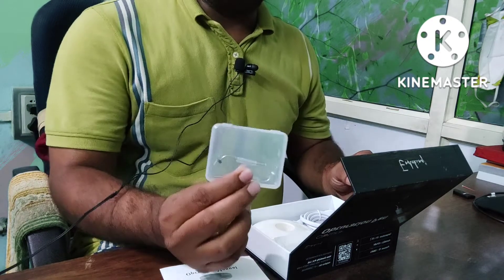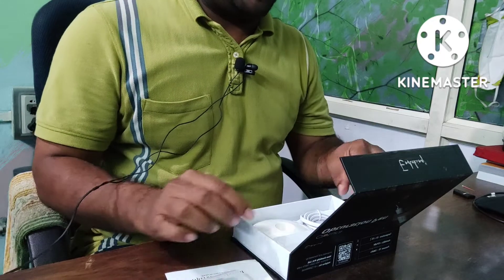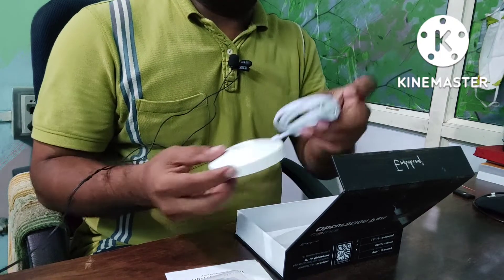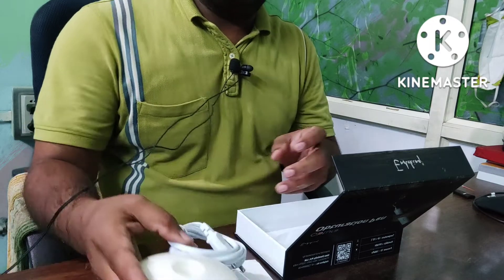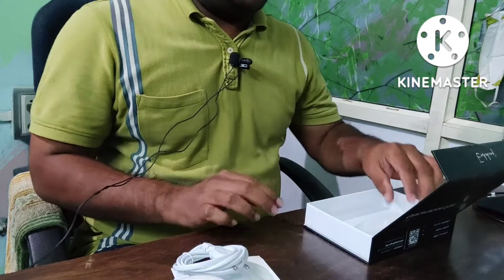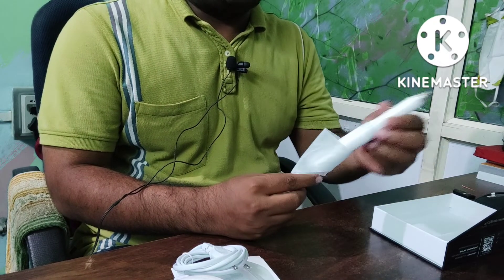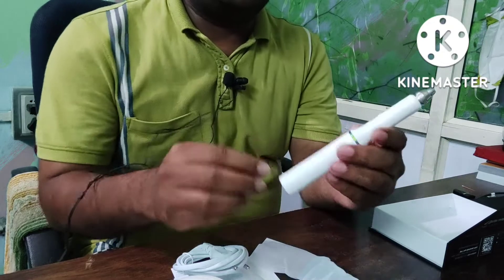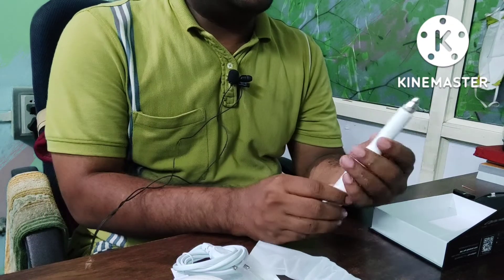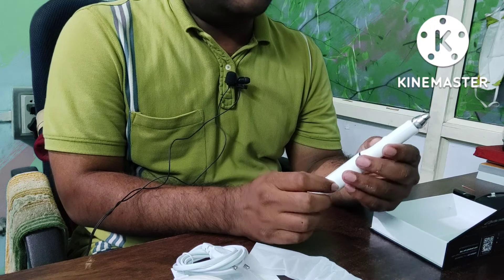This is the obturation pin. They provided two pins. This is the charging cable — very nice charging cable, quality is also good. And here is the obturation pen. It is well wrapped up. You can see this is the Endokine obturation pen. This button is for charging when it gets heated.